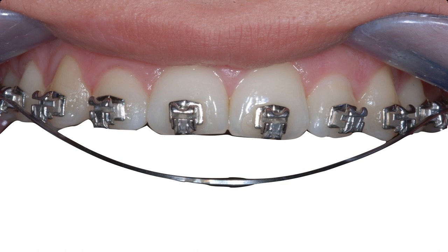Now that we have somewhat compensated the third class, we need to extrude those teeth to fix the open bite. In fact, bonding brackets more occlusally may favor proclination but it does not favor extrusion. What we use here is a reverse curve arch wire — a 17 by 25 NiTi. With that, we'll take care of the open bite.